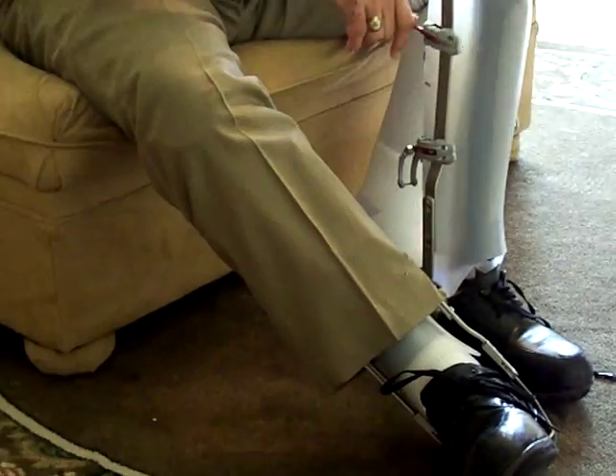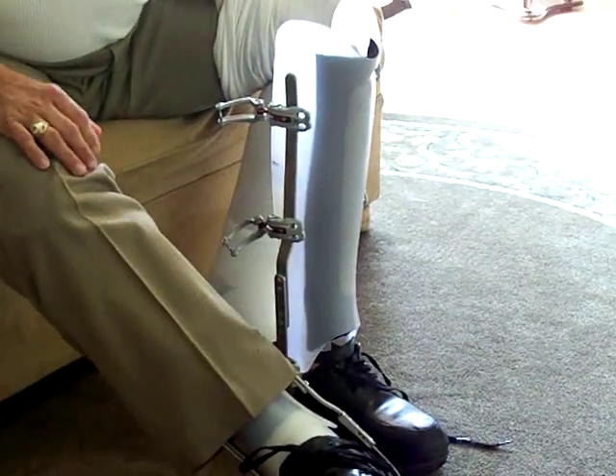So we come over here — same thing, repeat it again. And then we're ready. That's good.